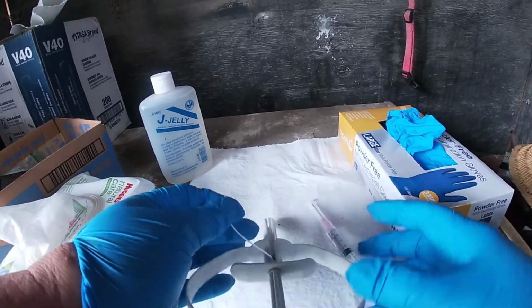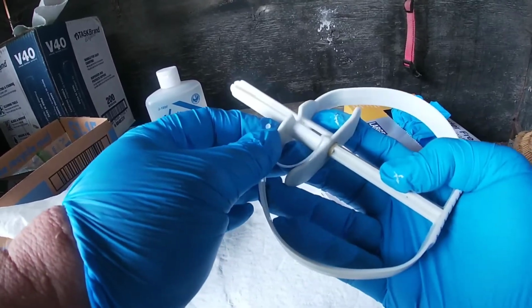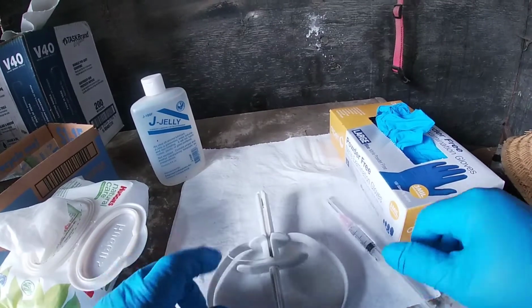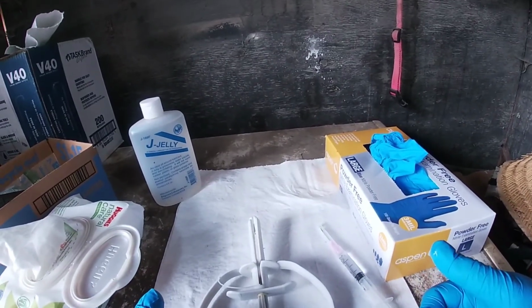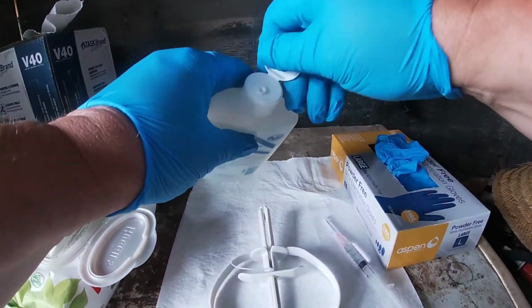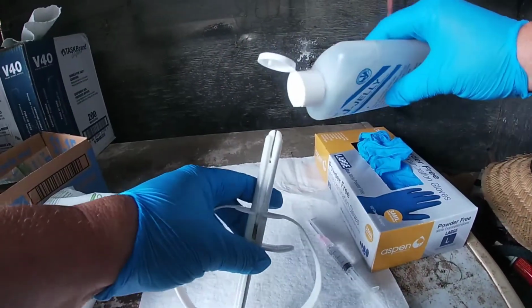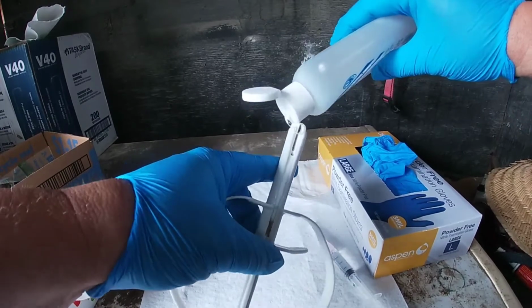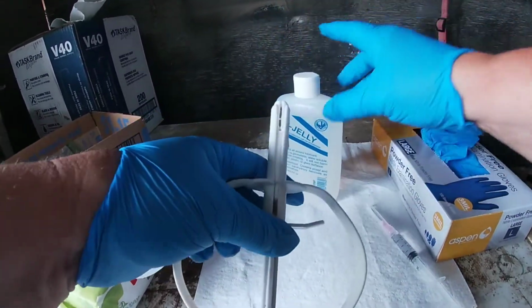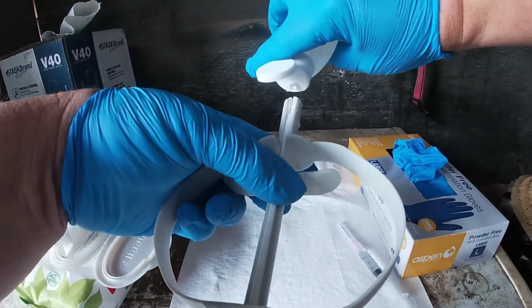So whenever you insert this into your doe, it'll stay in there for this doe, and the other doe that I'm going to do, for 6 days. This is what you call short cycling. You'll want to put some lubrication on. This is an older doe.